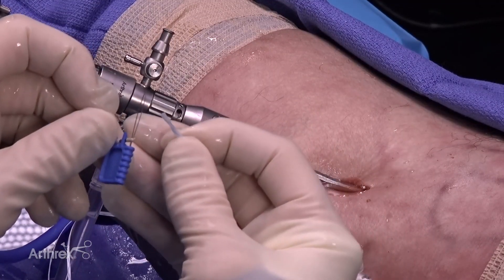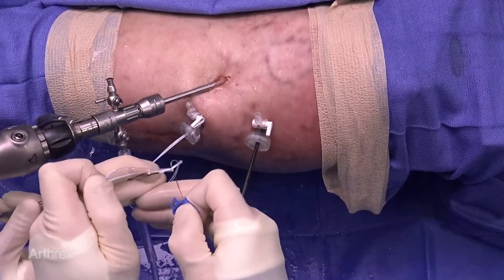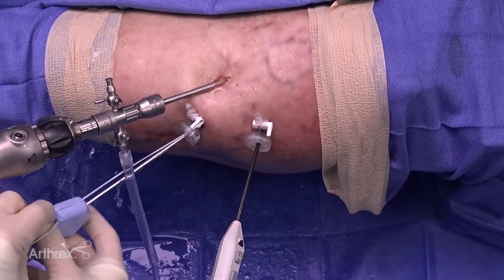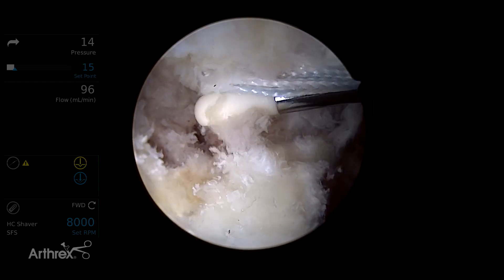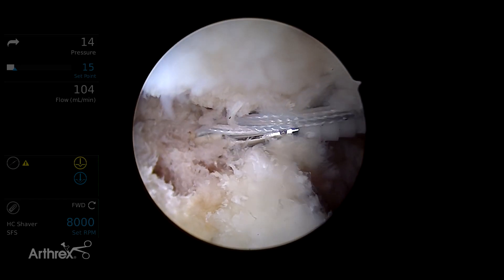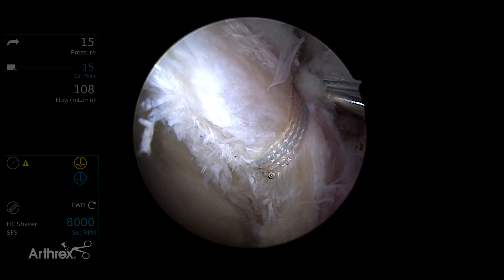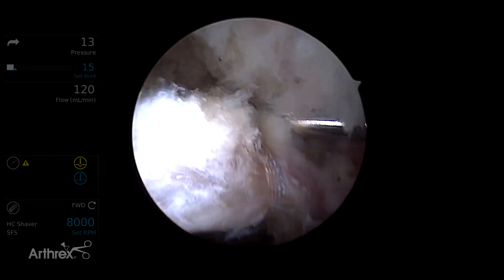The biocomposite anchor can be easily loaded with the suture tape. Without any suture retrieval, we are already through the DALA portal. Once anchored, it can be easily slipped down the DALA portal, ensuring orientation. With this position, the push lock can also serve as a slight retractor. You can then see the anchor placed in position — check your tension and ensure you like your tension.